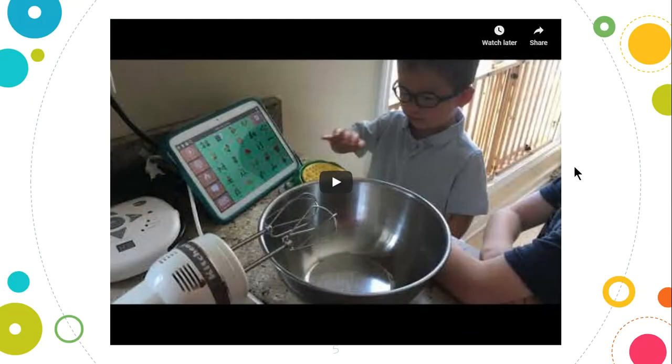All right, so you'll see in that video there, Mom just modeled some single words. She did some verbs like make, go, help, think. She also did some colors for the colors of the sugar, and then she did some pronouns, so I and you. So very simple. She wasn't doing a lot. You'll also notice she didn't really require Philip, the little boy who is minimally verbal, to do any responding. So she's just providing that input. And we're going to think of that just like an infant or a toddler who's learning language. We do a lot of language input, a lot of talking to that child before we even expect them to talk back to us. So right now, your expectation for your child is just to kind of learn from you.